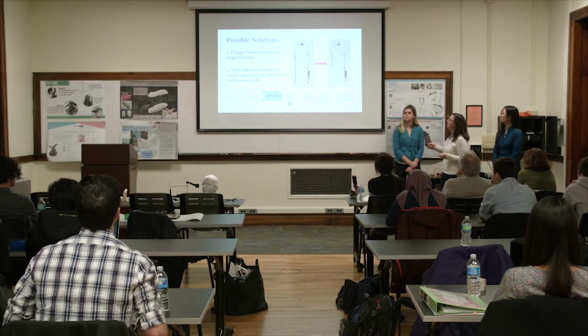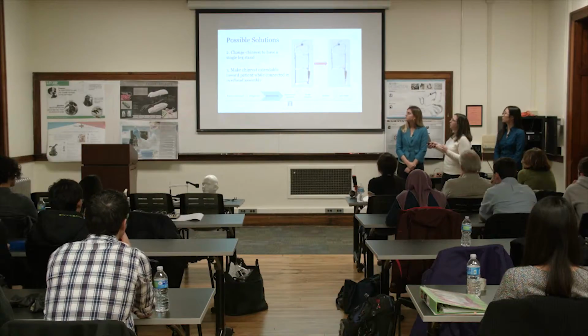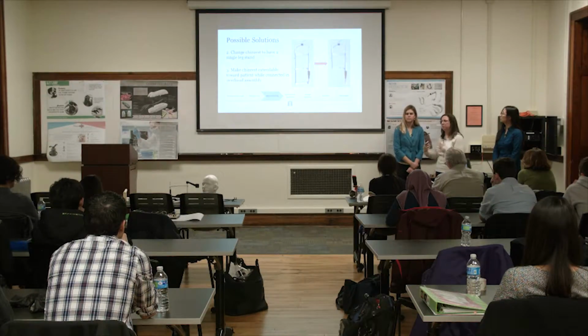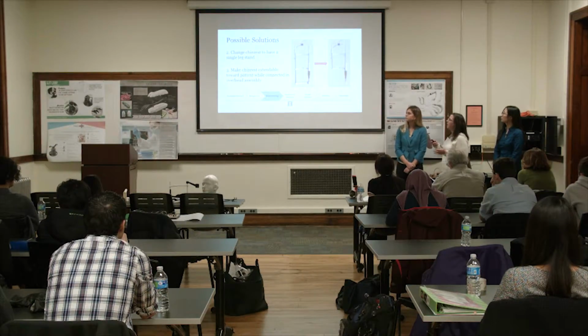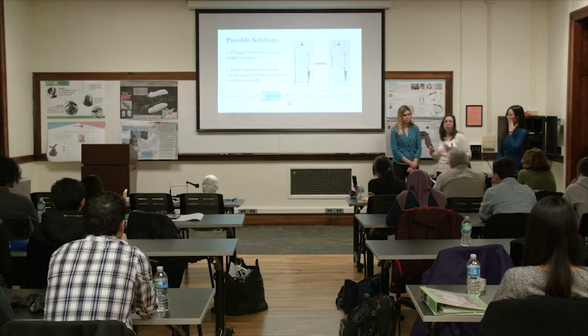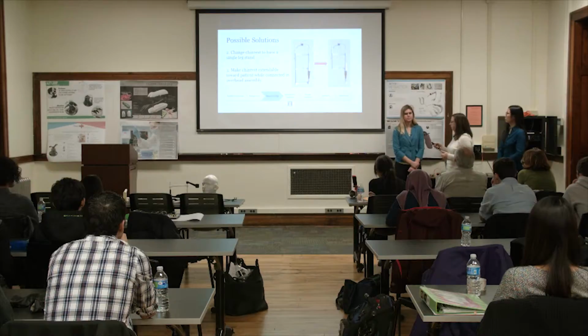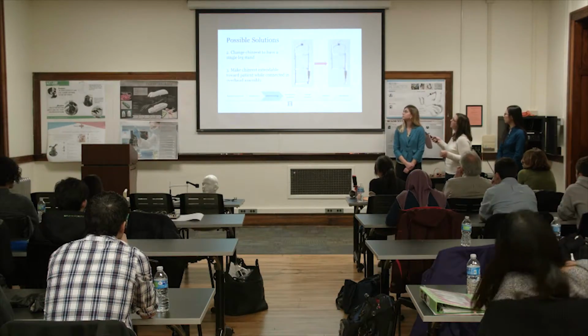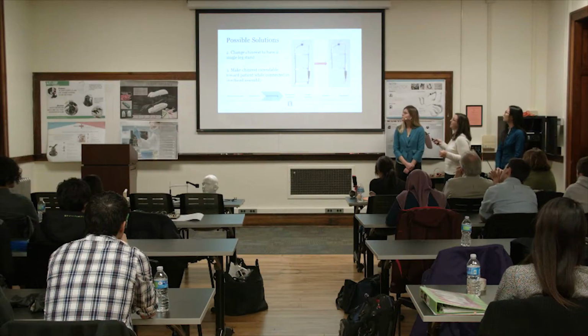So that was the first solution. Another solution we came up with is to change this current design to only have one leg, but it still presents a problem with part of the body being interfered with. And then we'd seen some other designs where the chin rest maybe is set back, and Dr. Sapersky had an idea: why can't we move the chin rest to the patient? We weren't able to really make that one work, but we did take this idea and expand it further so that the leg is attached on the side, so we combined two ideas into one.